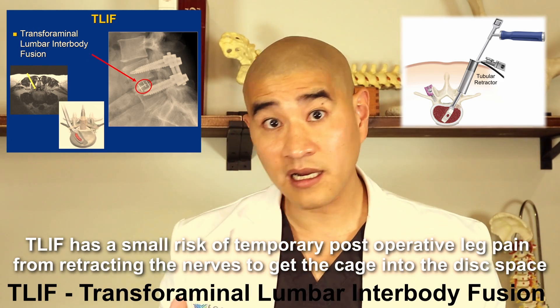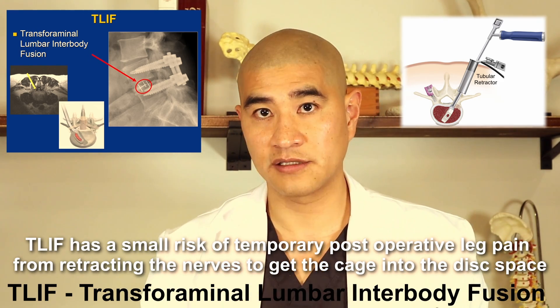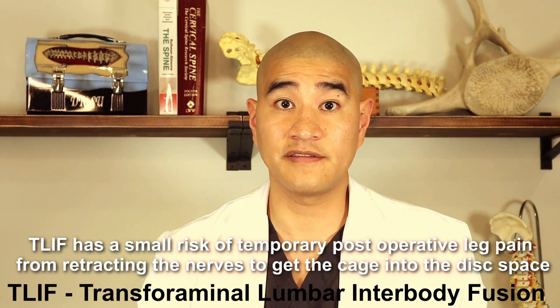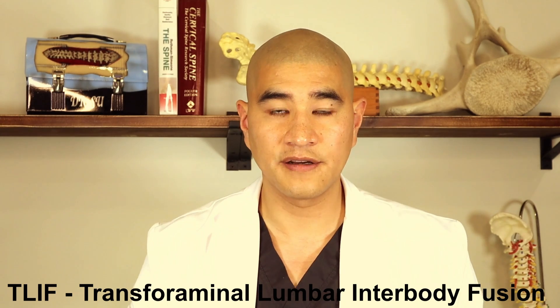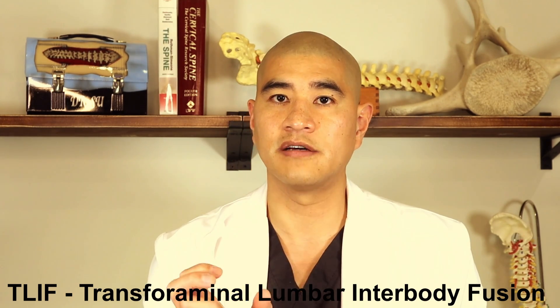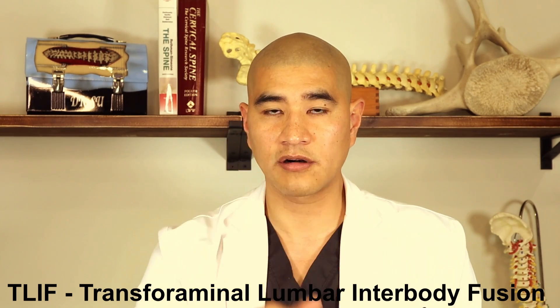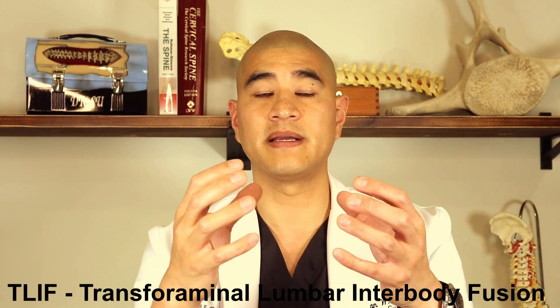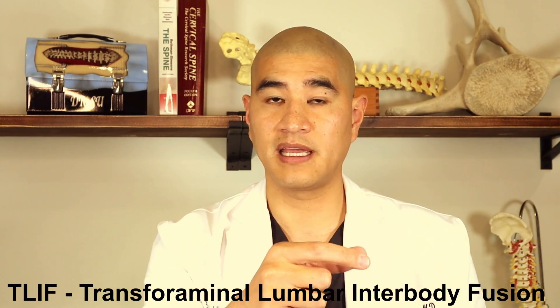The TLIF does not come with the risk of bowel injury, vessel injury, or femoral nerve palsy. But it does have the disadvantage of a smaller footprint. We use different strategies to do a thorough discectomy so that bone can grow across, and we often pack bone graft into the disc space defect before putting the cage in.